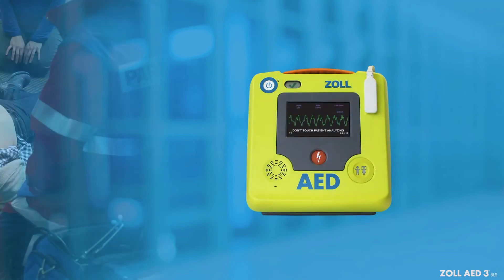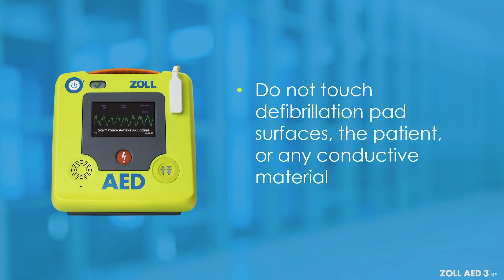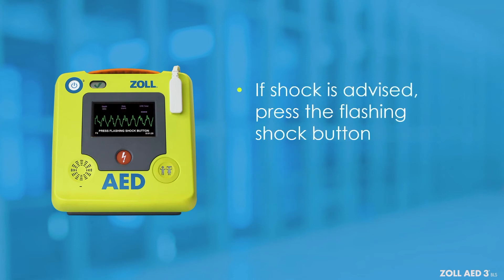Once pads are placed, the Zoll AED-3BLS will begin to analyze the rhythm. Do not touch defibrillation pad surfaces, the patient, or any conductive material touching the patient during ECG analysis or defibrillation. If a shock is advised, press the flashing SHOCK button to deliver a shock using Zoll's Rectilinear Biphasic Defibrillation Waveform.